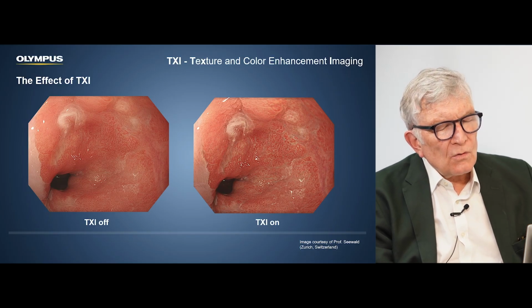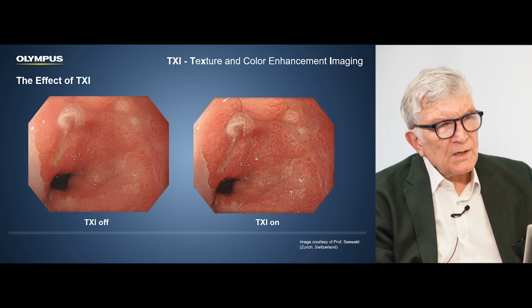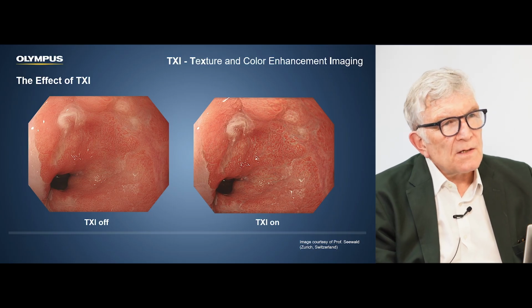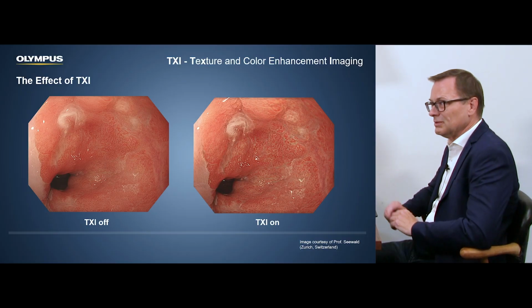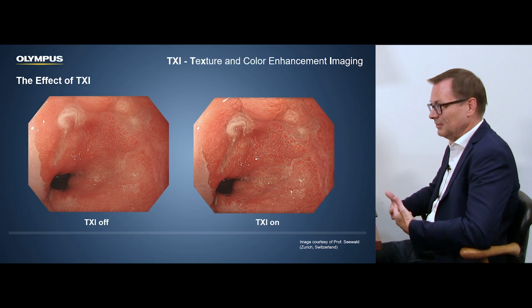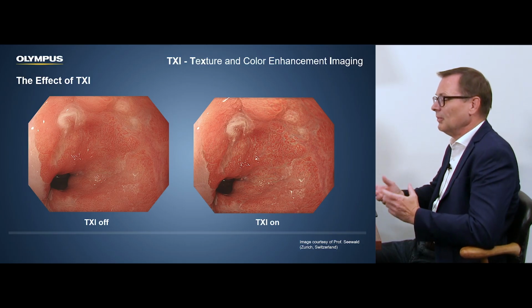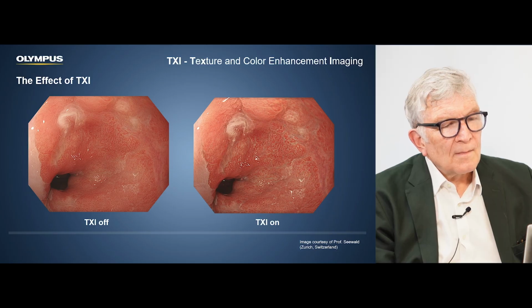You were talking about adjustment or optimization. Is that a constant one-time thing, or is it adapted all the time depending on whatsoever brightness and distance? It is a constant thing, so it's always done in the same way by the technical system, but it has been developed and evaluated with many physicians to tell the technical side, the engineers, where the optimum really is, because as an engineer I would not be able to do that.